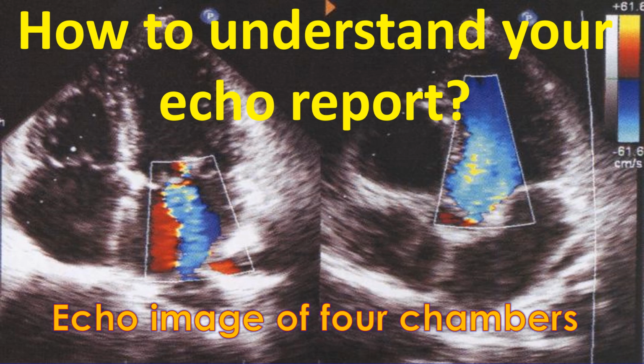Echocardiogram, often called just echo in short, is ultrasound imaging of the heart. Though the actual types and details mentioned in an echo report may vary between institutions and even persons reporting it, in general there are several common aspects. Reports of children with birth defects of the heart will have a different pattern. This discussion is mainly on an echo report from a general cardiology setup rather than a specialized report.